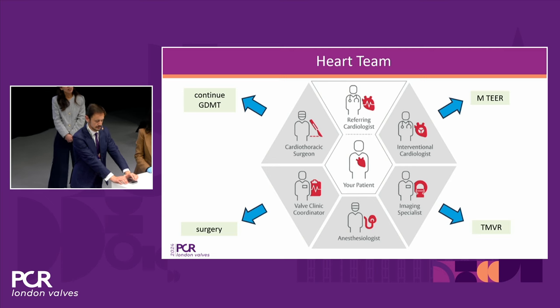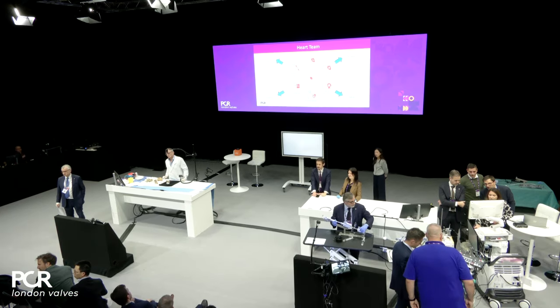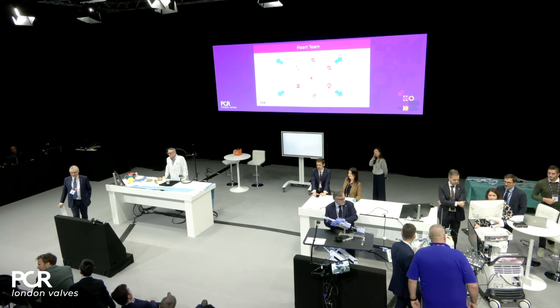I'd like to ask, because we agree that you need to reach symmetry in the commissures, when you're trying to fix a defect or a gap between the posterior and the septal leaflets, and you've got two posterior leaflets, which is quite common, type 3B of the Hahn classification, what would be your clocking for the device, please?